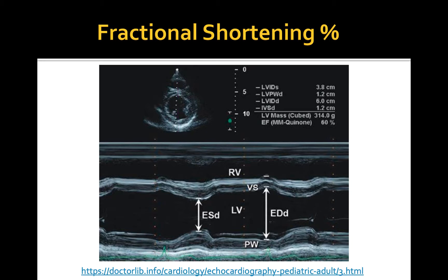On this image, you can appreciate an LV internal diameter during diastole, depicted as EDD, and during systole, depicted as ESD. End diastole coincides with the beginning of the R-wave on ECG, and end systole with the end of the T-wave on ECG.